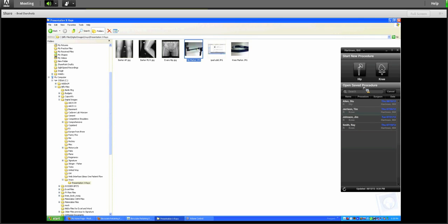A case has to be initiated from either a PC or a Mac, because you have to have the ability for one program to be running on top of another program and have visibility to both programs at the same time. That's a limitation of the iPad. We have some concepts of how that might work, but that'll be for a future release.